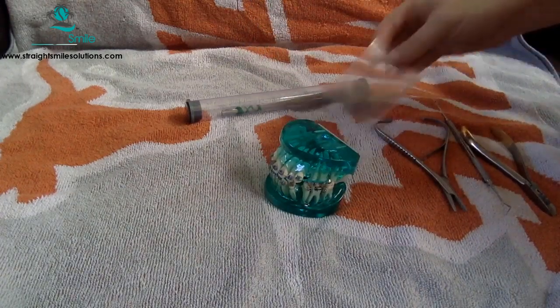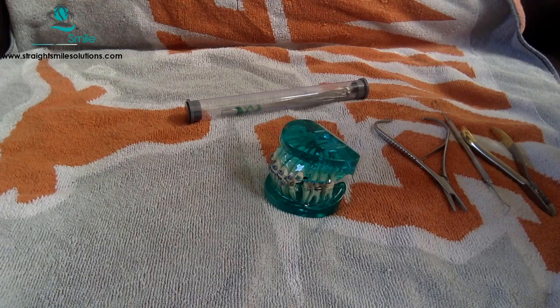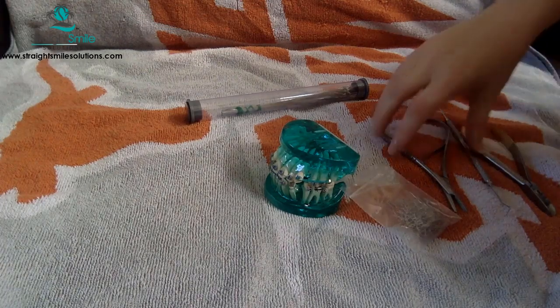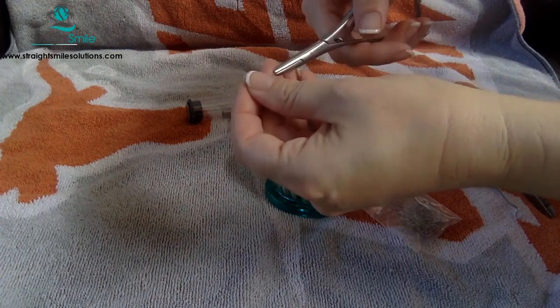A synonym for stainless steel tie might be quick tie. Some people call it that. Some people call them steel ties. Stainless steel ties, SST, SSQT. Lots of different ways to say it. Okay, so I'm going to be going over shorties and longies today. This is just what I call them.